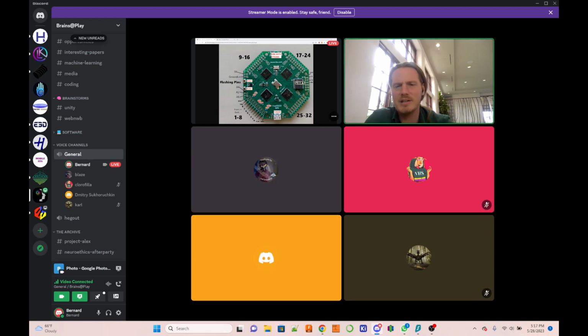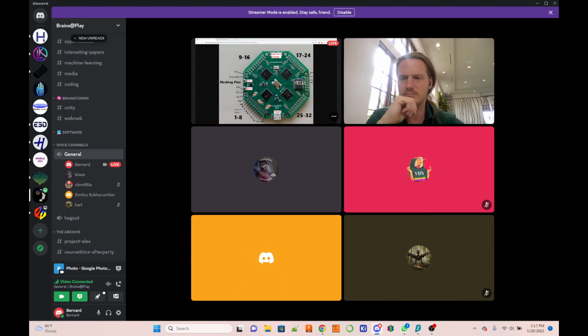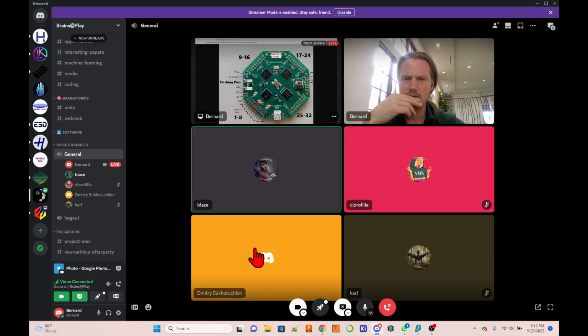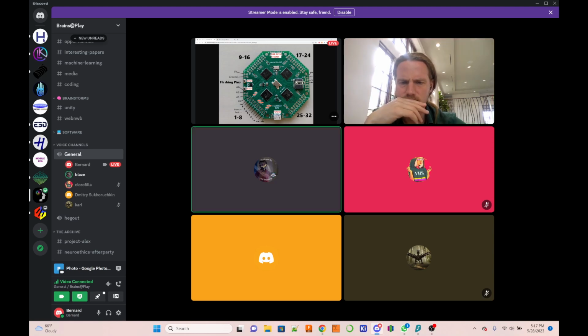The thing is, instead of having all that collected, we have to do that physically, pin by pin here, with the negative pins, channel by channel. The interconnection of the negative terminals. More hardware, but I think it's conceptually easier, to be honest. You need more wires, but I think it's conceptually easier.